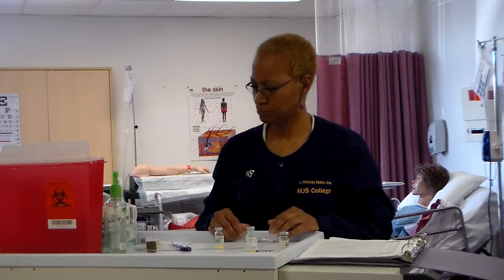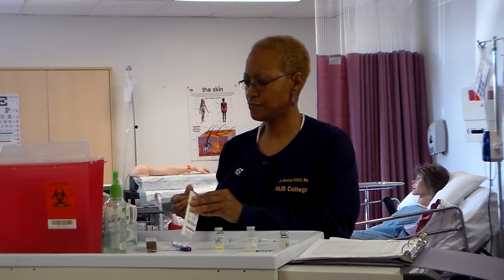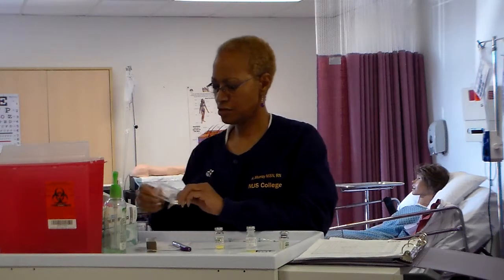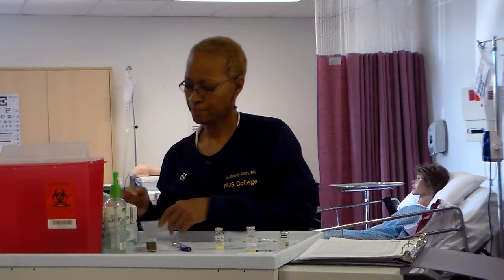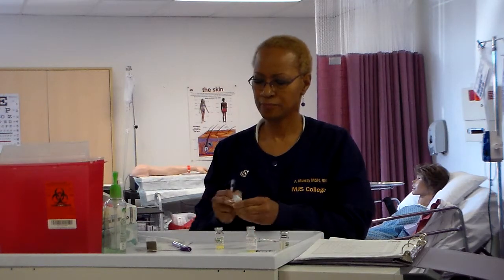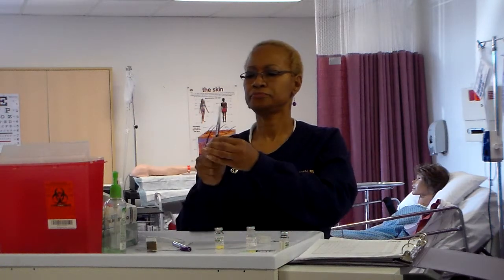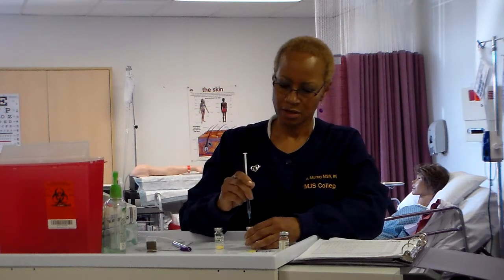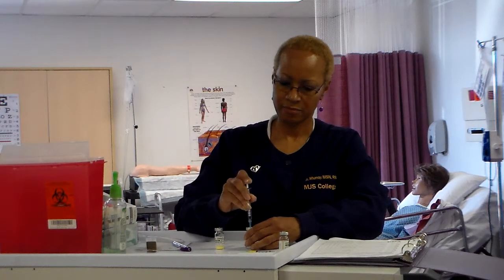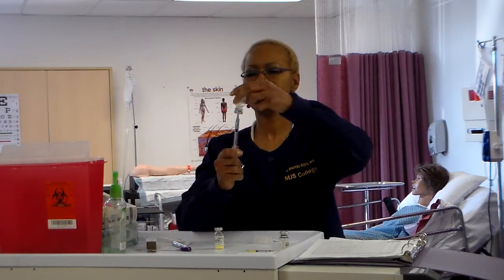Draw up diluent into syringe following steps 2 through 8. Okay, so we're going to do the same thing that we did with the other medication. Little tiny needle. Insert tip of needle through center of rubber seal of vial of powdered medication. And not yet.